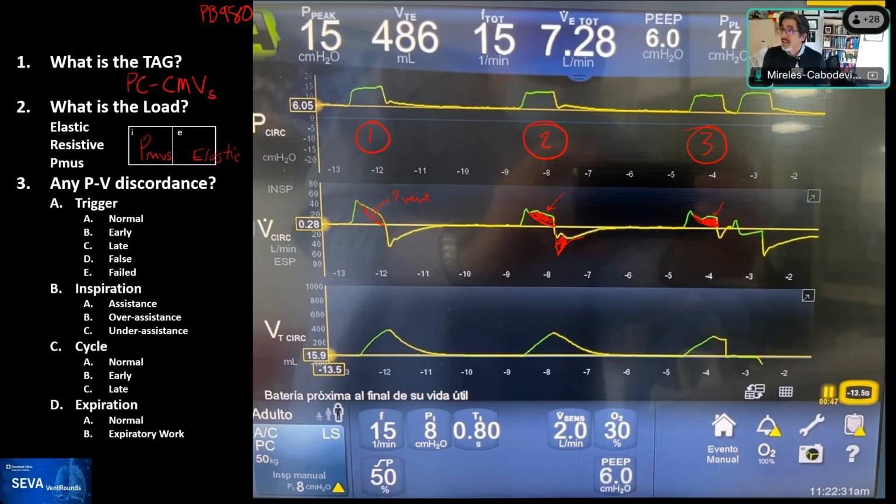I love it, and actually they're calling it now. I mean, there's a software that they tried. There was a paper by Albani called flow index, and they saw the curvature of that curve the same way that they would do a stress index, but they were looking at how far away it was from that. Although they didn't do the exponential decay, they said a straight line, but it's about the same.